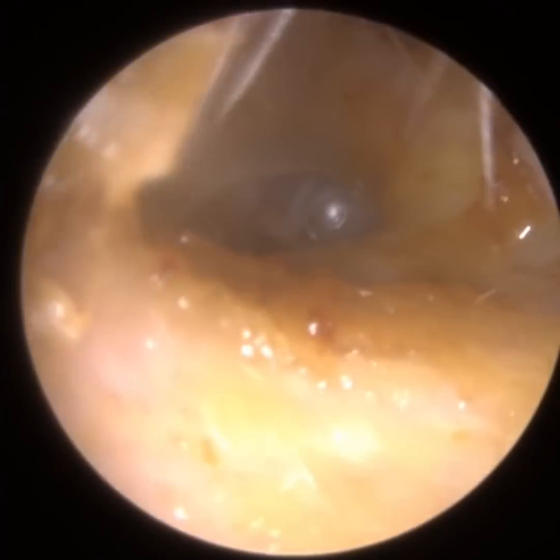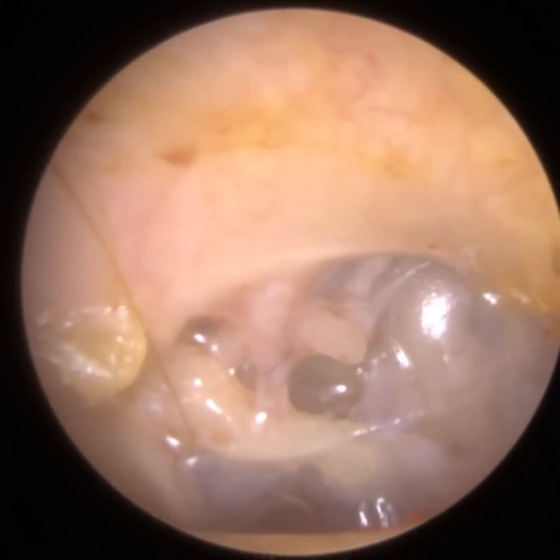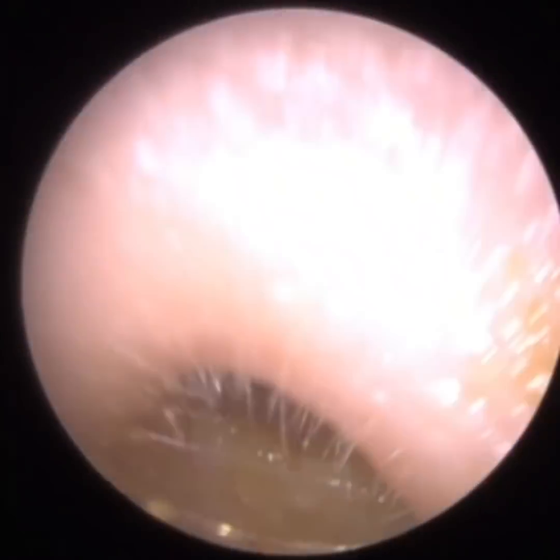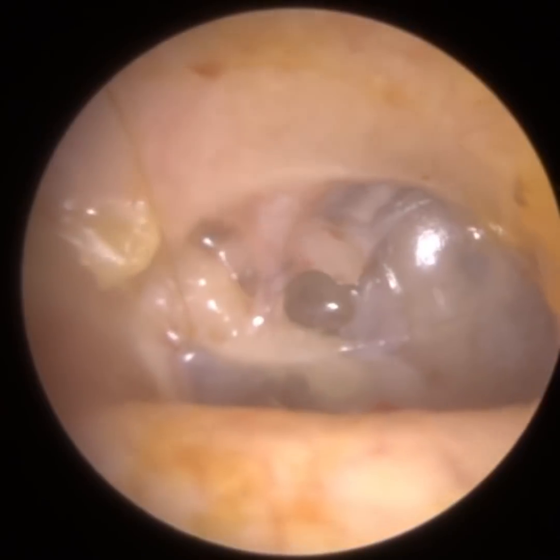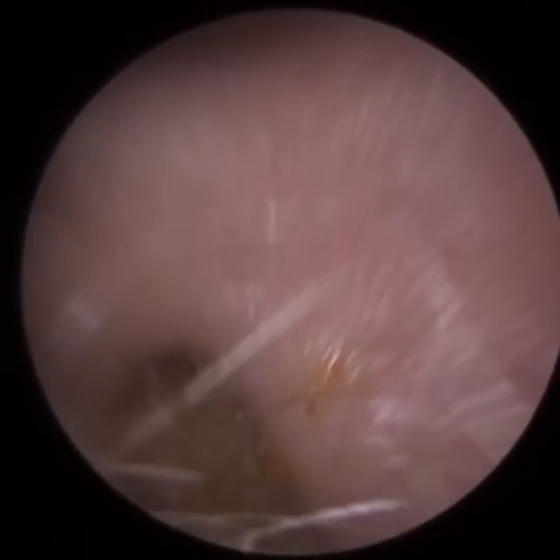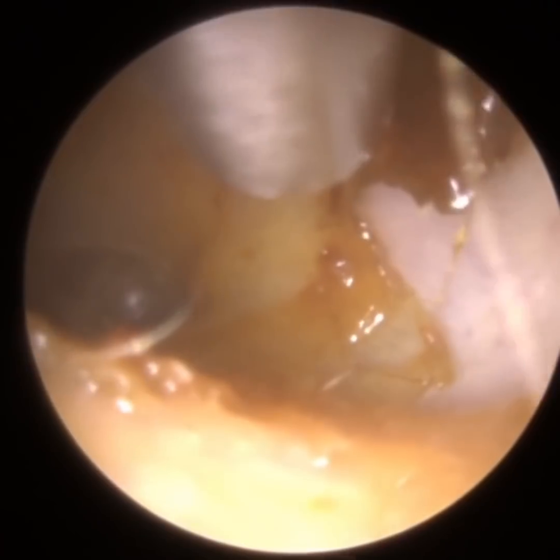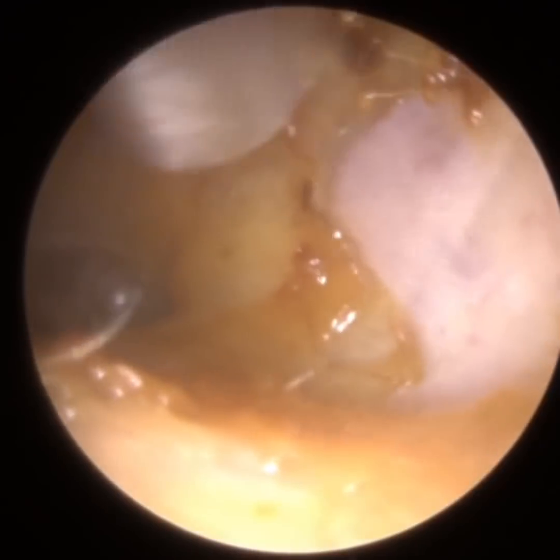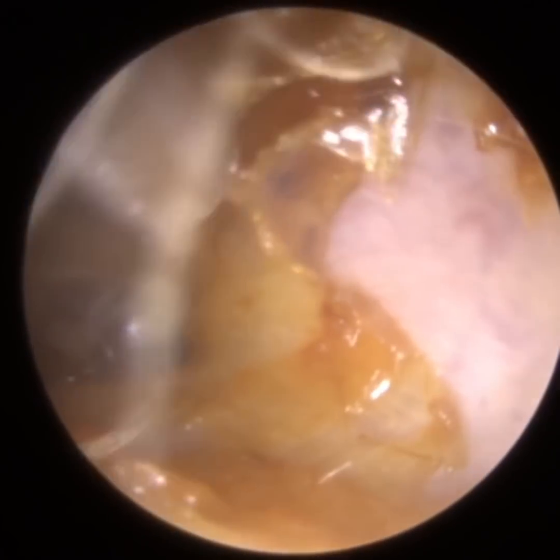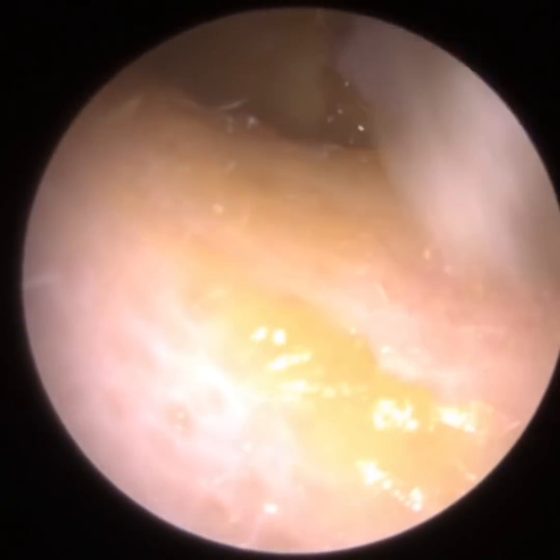This is the patient's left ear now. The entrance is really, really narrow again, so I just have to widen this ear to get in there. The wax came out a bit easier. I've taken a screenshot of this — you'll see it in a moment. I know there's a hair there; we're not going to try and take it. It's not going to affect the patient — I'm not going to perforate the patient's eardrum going for a hair that's generally quite stuck on the drum; it's really hard to remove. There's some dead skin posteriorly that I'm trying to remove. I've got this out and it started to clarinet. Clarinetting is when it violently flaps and makes a really loud noise — we're just going to leave it there. It's not a problem for the patient; it's going to mop up near the entrance.